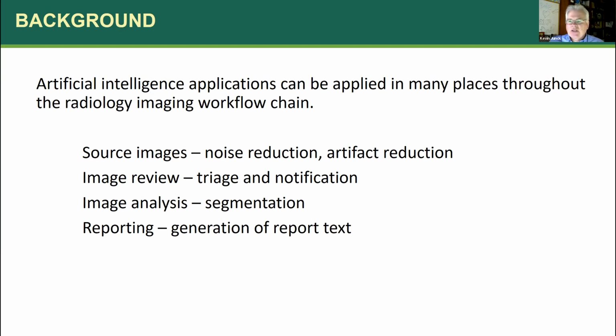And now these, as you've been learning in the beginning section of the class that I think was last fall, and talking about in this intermediate level class, artificial intelligence applications are going to come in throughout the whole radiology imaging workflow chain.